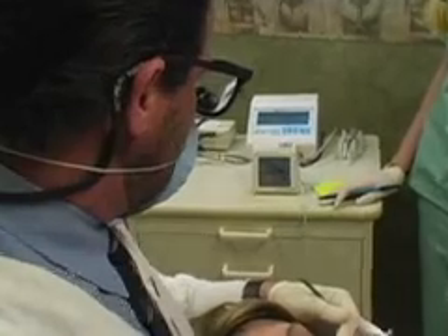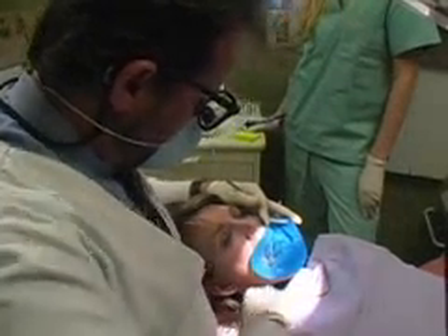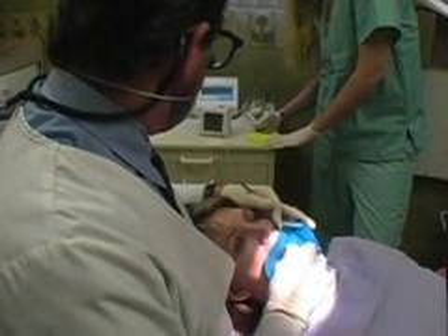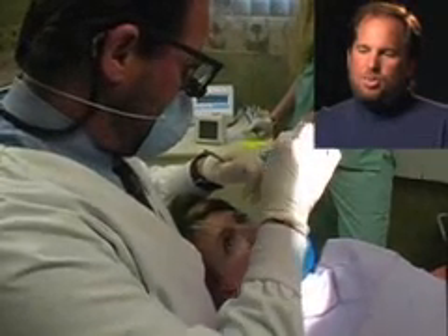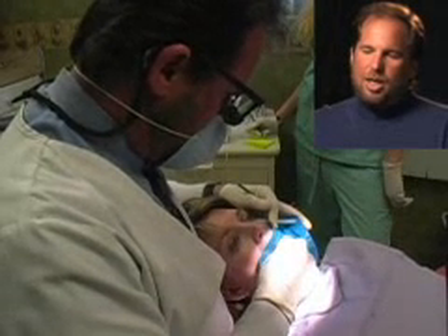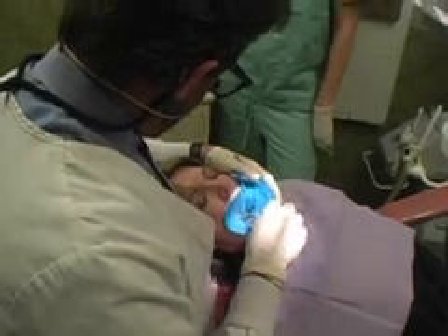We're measuring the tooth roots with the apex locator — I'm clipping it on now. I'm looking at it to verify the root length. My assistant Joelle is recording those measurements. You need to know how long the tooth roots are before you can completely remove all the infected tissue, and also when you ultimately fill the root canal, you need to know how far to place the filling because you can't really see underneath the jaw. This tooth had four canals — each canal has to be measured, and that's what we're doing here.